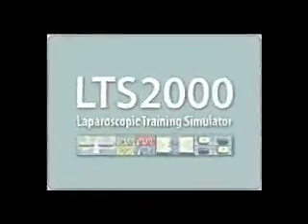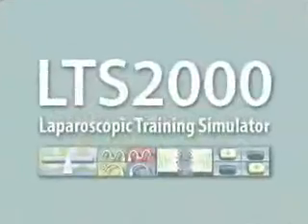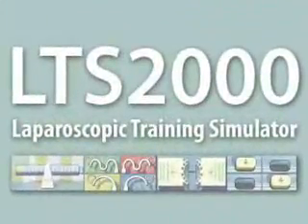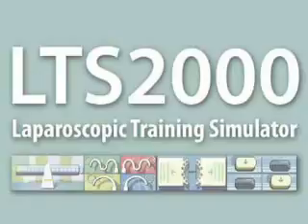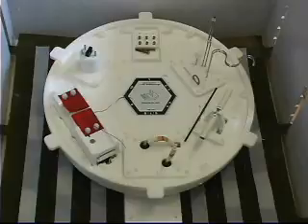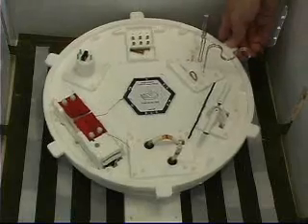The LTS2000 is a physical simulator designed for the acquisition and evaluation of laparoscopic surgical skills. It is the first physical simulator which combines ISM60 interactive sensing technology, which permits electronic scoring and feedback. The ISM60 sensor carousel includes 10 tasks.